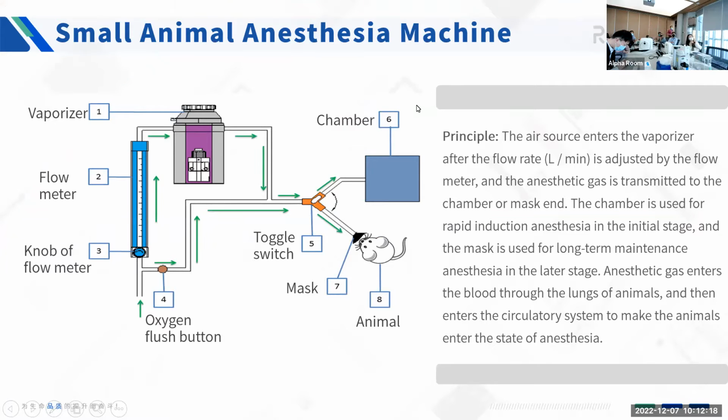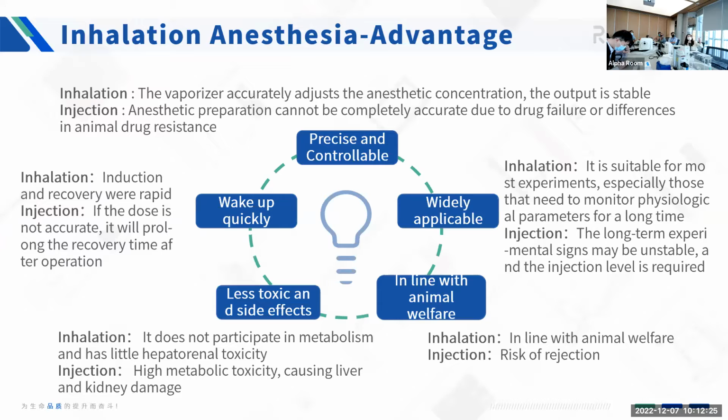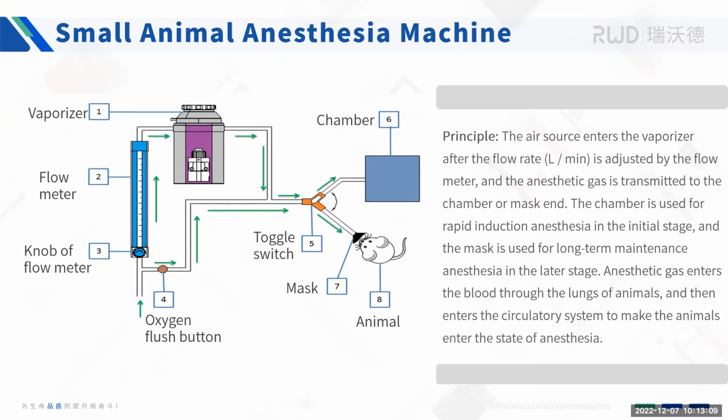Actually, this is a method for inhalation anesthesia, but in the market, the customer may use injection anesthesia. Yeah, but for our anesthesia machine, we use inhalation anesthesia. So this is the difference between the inhalation anesthesia and the injection anesthesia. Yes. Yeah, that's true. Okay, let's go on.